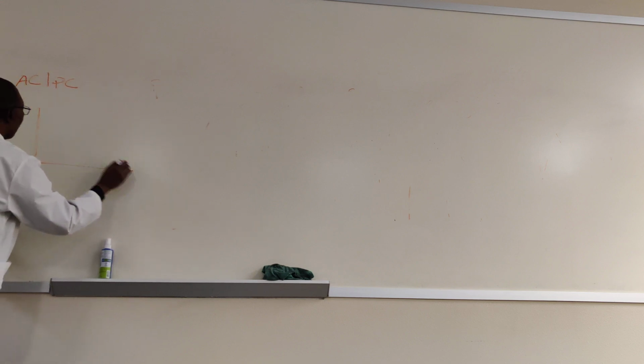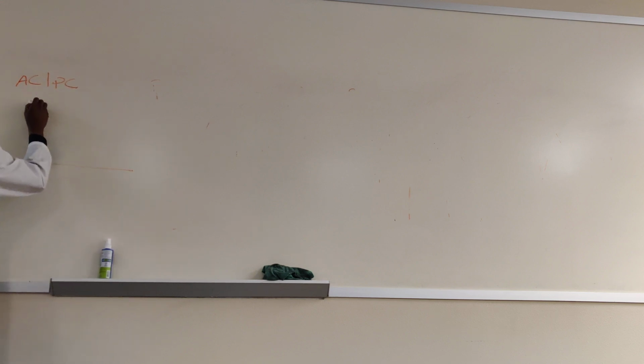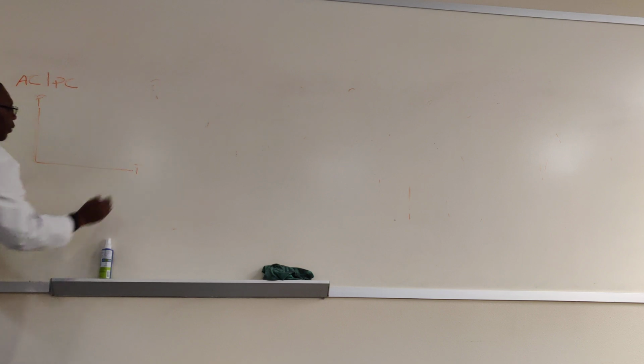So pressure control, AC PC. Okay, here's my pressure time curve, pressure time. Well, on pressure control, AC PC, the patient can trigger, the machine can do it.